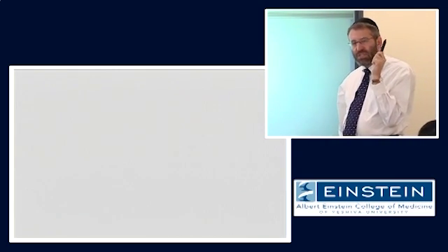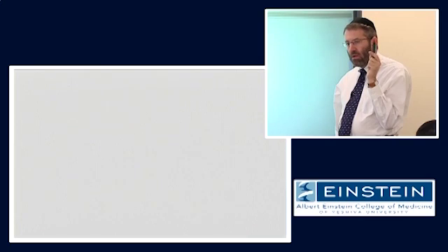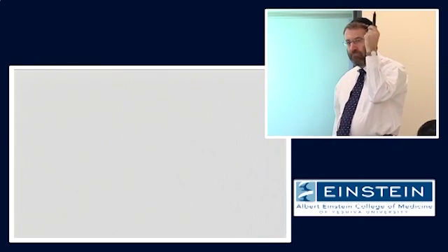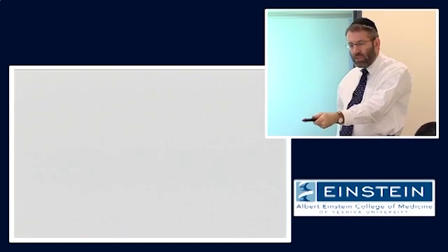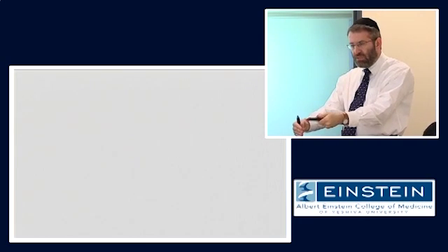Now, it turns out that, on the other hand, let's say we have a situation where our TR is very long. TR is very long, T1 is very short, so we're in this steady state where we recover all of our magnetization on each successive TR.